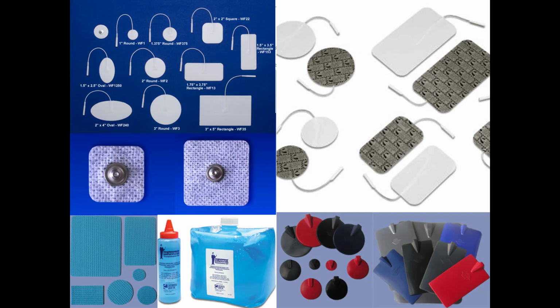Number 3, adhesive-backed carbon or silicone-impregnated rubber electrodes. Adhesive is used in place of a sponge or paper towel and a rubber belt or sandbag. These are quicker and easier to apply, but are more expensive than other systems. They were intended to be single-use disposable electrodes, but most people reuse them 8 to 10 times, or until the adhesive loses its stickiness.